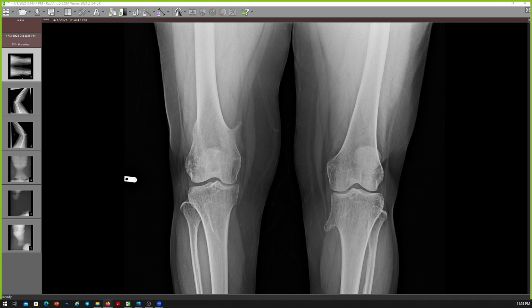Regarding the management, in some of the cases, just like in this case, you were perfect in completing the management, but then sometimes you forget about the management. So yes, do not forget in the exam. And one thing also pleased me about you is that you call the clinician and tell them about the findings urgently whenever there is an emergency.